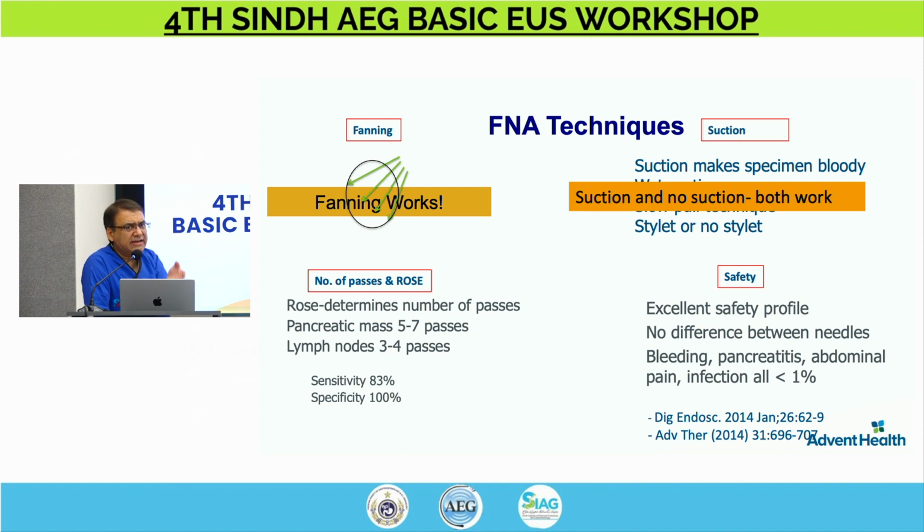So at the end of which I'm doing back and forth, I don't want to use suction because suction always pulls the blood in there. So I want at the tip of the needle, or the most distal part of the needle, without suction, even when I'm using a suction. If it's a fluid, you need a suction. If it's a solid, I don't use suction.